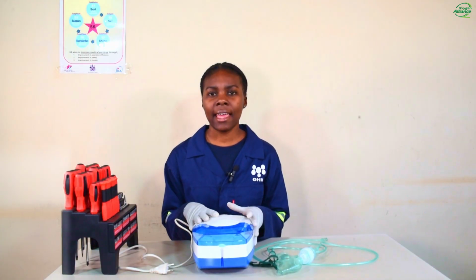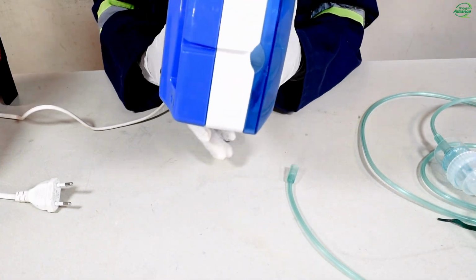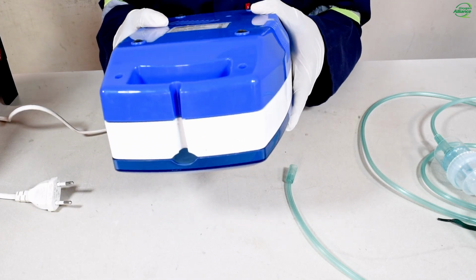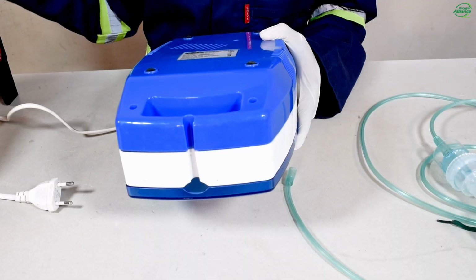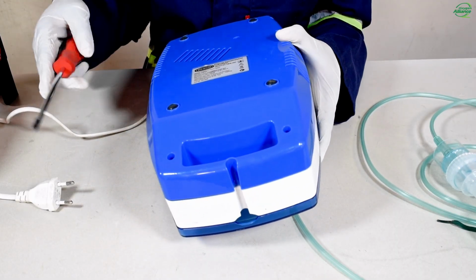This nebulizer's compressor draws in ambient air and compresses it to a pressure of 9 to 19 psi. To help you understand the airflow better, I'm going to open the machine. This nebulizer has a total of 7 screws. I'll use a star-head screwdriver to unscrew the screws.